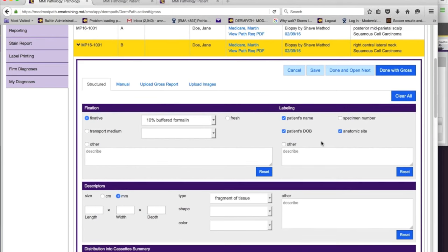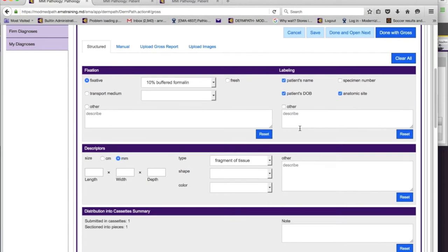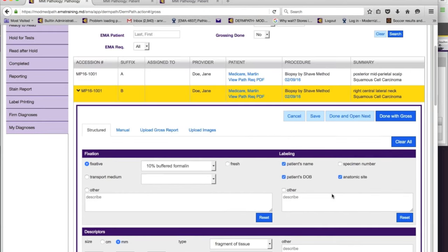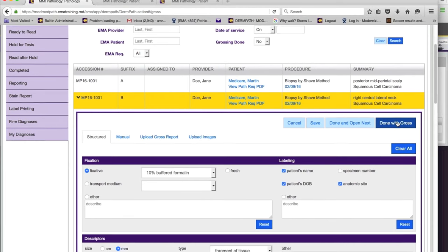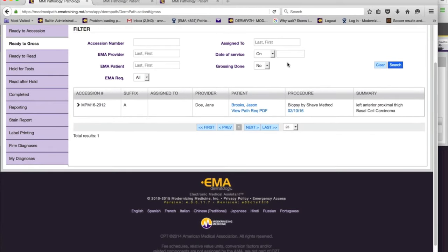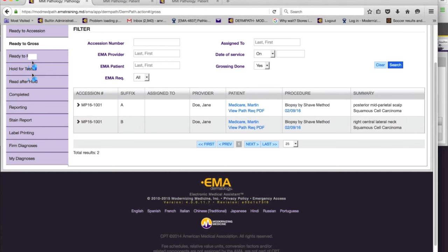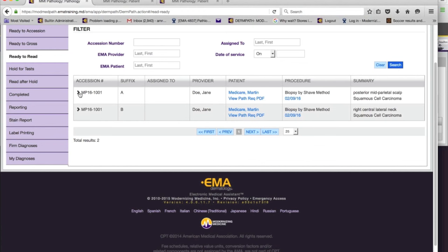I'll say 'done and open next' — it closes this one and opens the next. As a histotech in the lab, you can move from one case to the next in order by accession number. I'll do this case quickly, put some size in, and say done. When you finish, cases disappear from the screen to remove clutter — they don't go anywhere. There's a filter that defaults to 'grossing done: no,' so if you want to see them at any time, change it to 'grossing done: yes' and search. Once done grossing, they move to the ready-to-read screen.